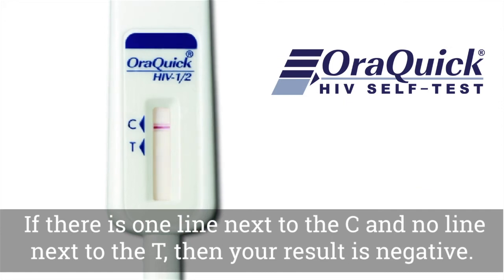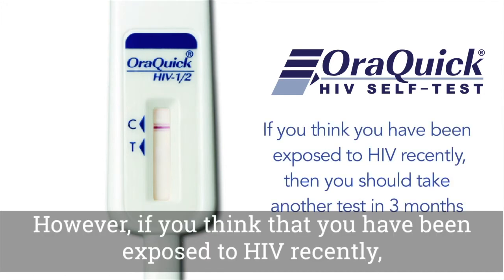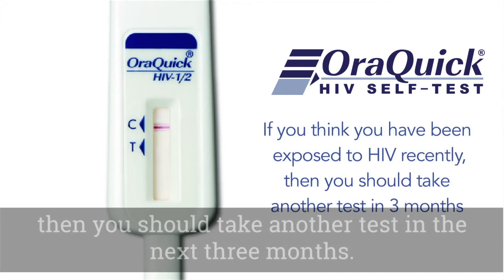If there is one line next to the C and no line next to the T, then your result is negative. However, if you think that you have been exposed to HIV recently, then you should take another test in the next three months.